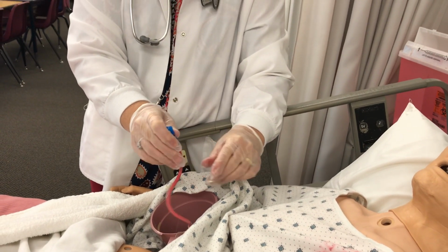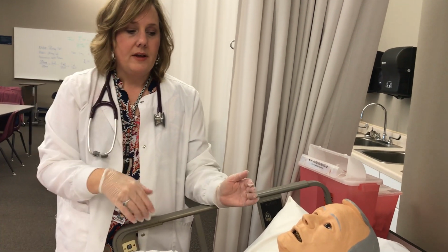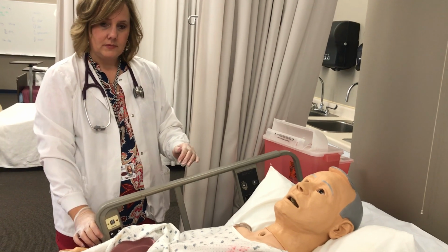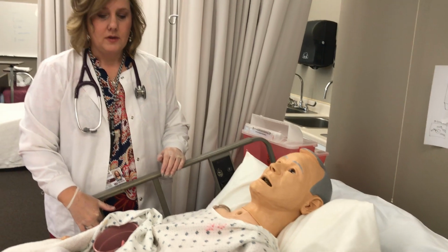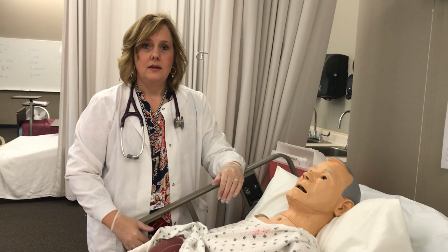We'll also want our patient to stay elevated, the head of the bed, for anywhere from 30 to 60 minutes after the feeding to help with digestion. I'd like to remind you that the position your client needs to be in is a Fowler's position. So you want them sitting up a little bit more than this. If that's contraindicated, you can turn them slightly over to a right side lying.